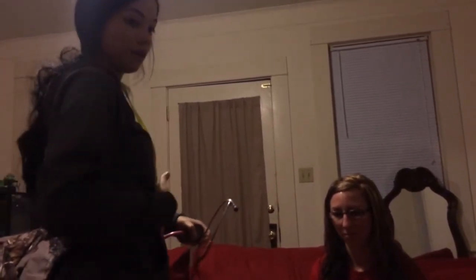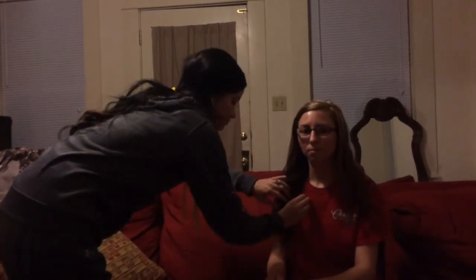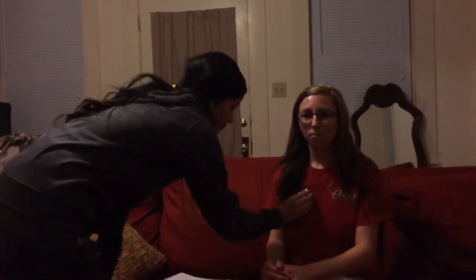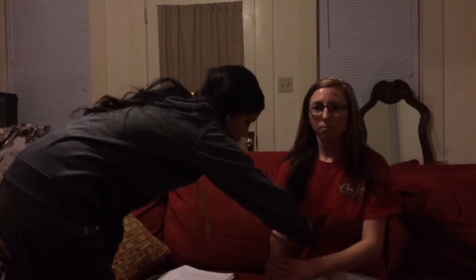Now I'm going to auscultate. I'm going to start off by listening above the clavicle and work my way down to all the aspects of the lungs. When you feel my stethoscope touch you, just take deep breaths in and out. All right.